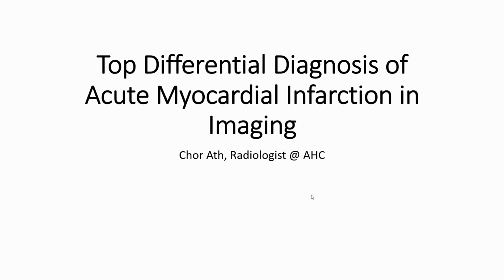Hello everyone. Today I'm going to talk about top differential diagnosis of acute myocardial infarction in imaging. First of all, I would like to review acute myocardial infarction in imaging.